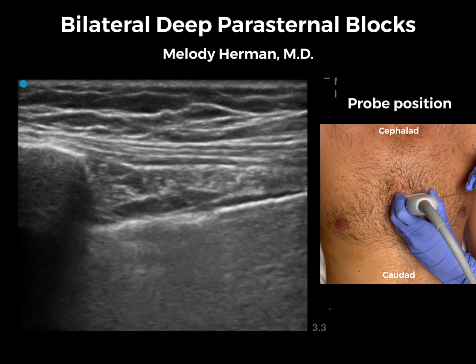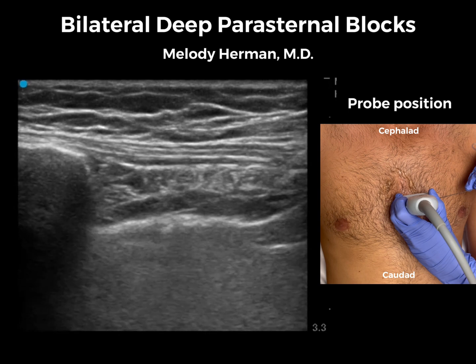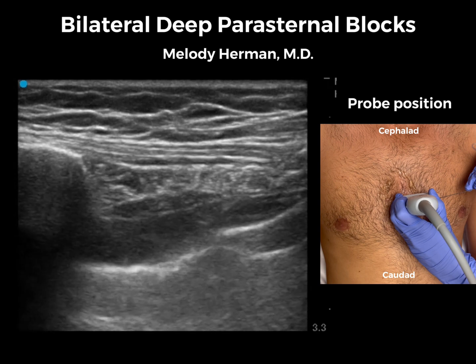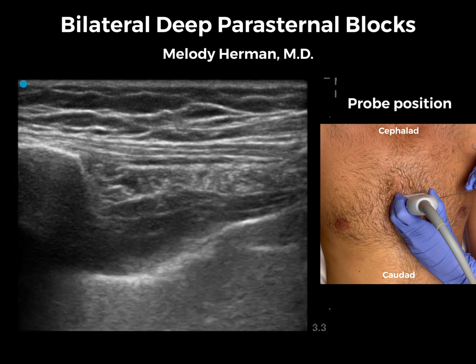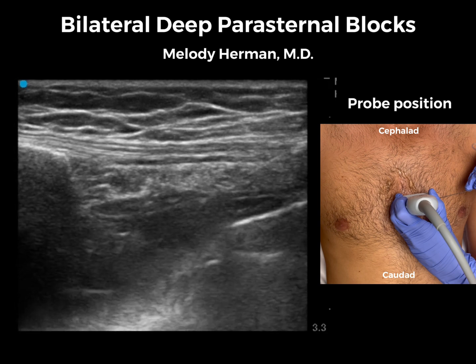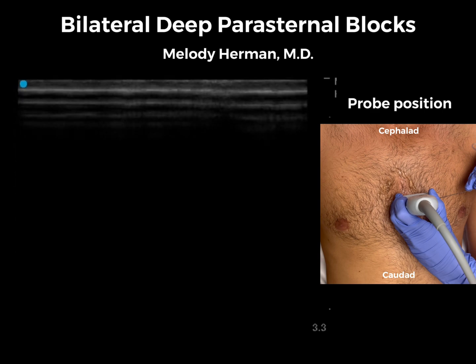Just like the other side, we are going to advance lateral to medial in-plane, and once we are below the internal intercostal muscle we see that with our saline injection the pleura depresses really nicely. We don't see the transversus thoracic muscle — we're not surprised. We'll switch to our local anesthetic, administer that, and once complete we have finished our bilateral deep parasternal blocks.